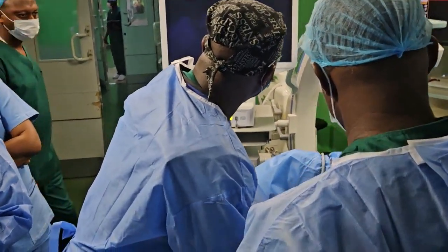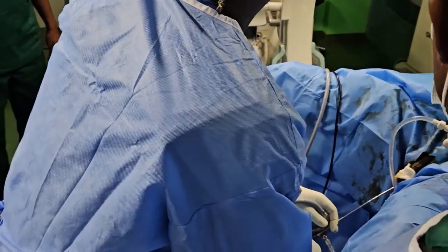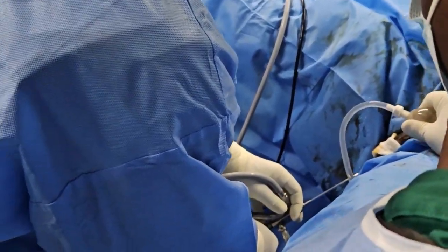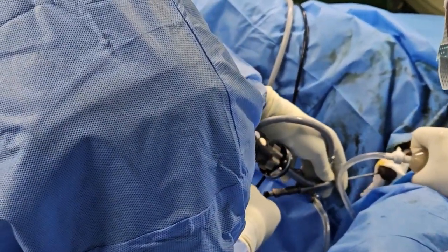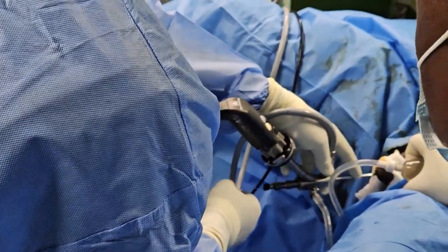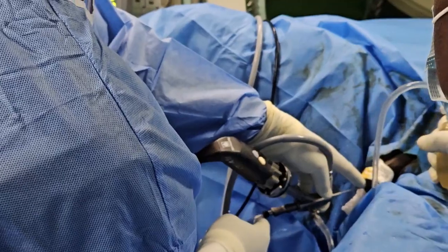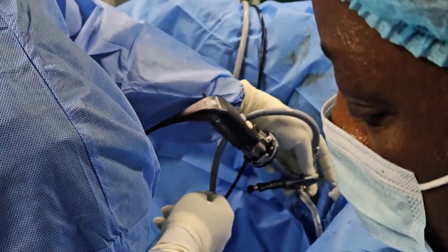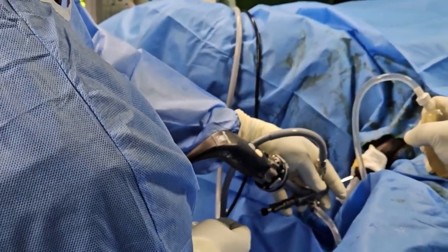What are you doing now? So he's about doing the back loading through a semi-rigid ureteroscope. It's in the ureter, so he's trying to get to the PUJ. He's got his zebra guide wire in there. You can see it, going into the ureter all the way up to the PUJ. He wants to see the PUJ and make sure his wire is deposited there. So he's at the PUJ now. So my wire is in. Semi-rigid, isn't it? Yes, semi-rigid.